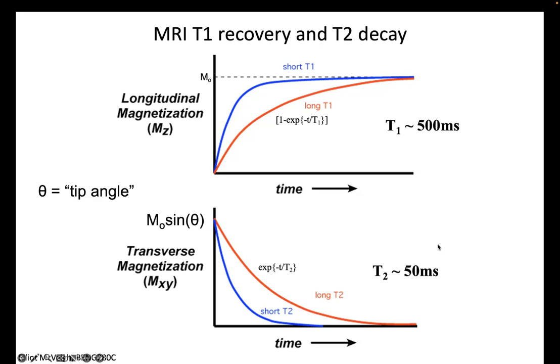And this is what generates contrast in MR images: different tissues have different T1 and T2 values. And so we can generate brightness in, say, things that have long T2, or we can generate brightness in things that have short T1. So if you have short T1, you come back to a higher signal more quickly. And then if we choose to apply a radio frequency pulse like right here, this tissue will show up bright because you get more signal from it than you do from this tissue.